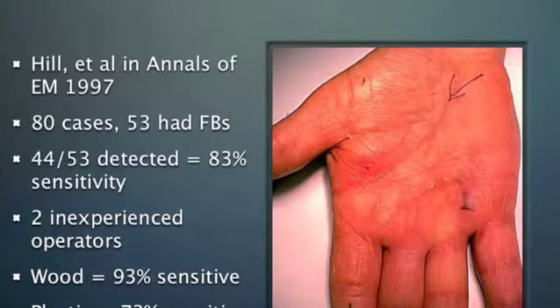This was a case of a patient who came in who said they fell on an outstretched hand onto a toothpick, and this was the site of entry of the toothpick. With ultrasound, the toothpick was actually located way over here. Before using ultrasound, if I was even able to see a toothpick on x-ray, I would have really been lured into opening up this area, searching around for a foreign body. However, the ultrasound is very successful in localizing it where it needed to be, which was where the toothpick wound up.